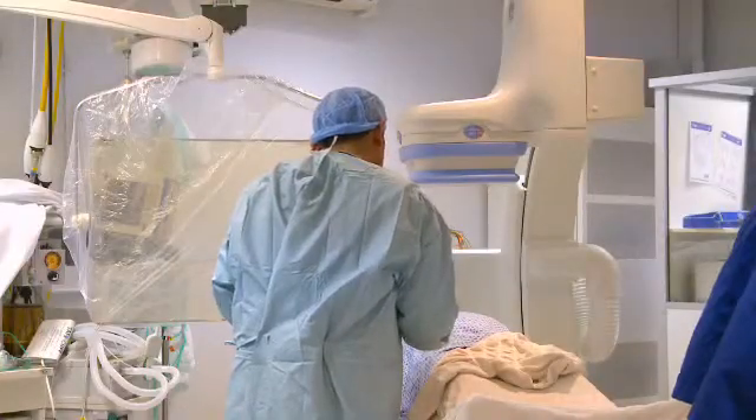At the end of the procedure we will remove all of the catheters and wires. The stent will stay in place in the coronary artery holding the narrowing open. The whole procedure should take somewhere between 30 and 60 minutes.